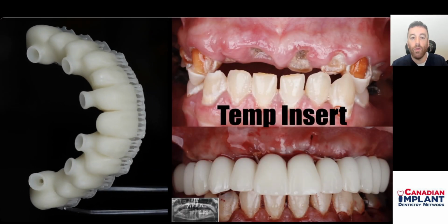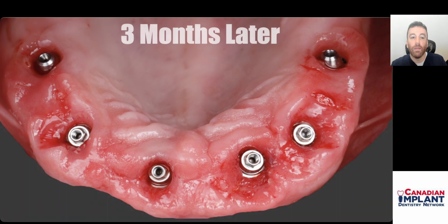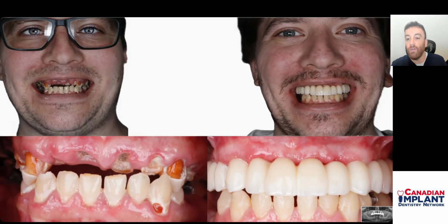For Mark, we're able to do a same-day temp insert. This is printed same day. 3 months later, you can see abundant, robust, healthy tissue on first disconnect of your temporary. We finished the case for Mark in monolithic FP1 zirconia with Mio liquid ceramic staining. And this is how we finish his case.